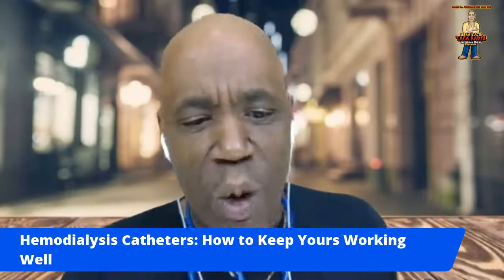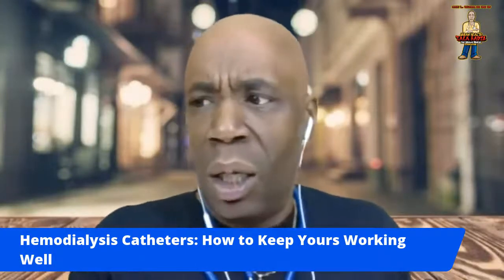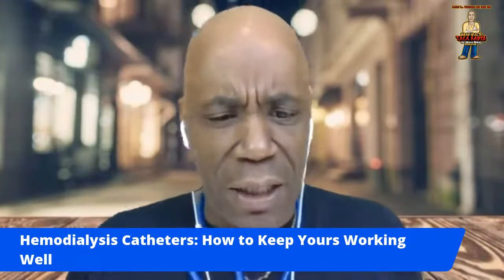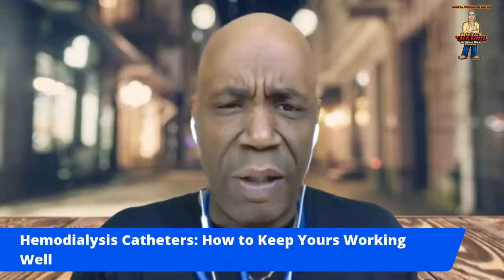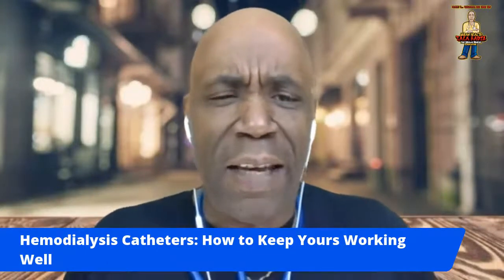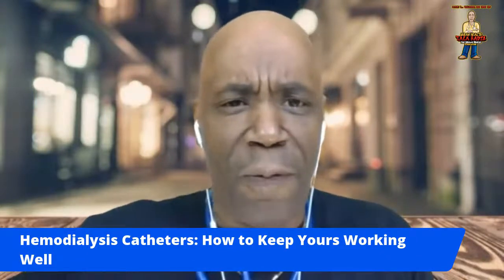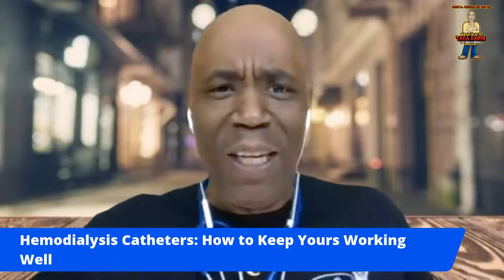Another question. Ask them, what is the flow rate that your doctor ordered? You want to know that. What is your blood flow rate that your doctor ordered when he started you on dialysis? Because some technicians, if your catheter is not working or if it's an issue, this is the real deal. As they say, for real, some techs, they don't tell you anything. If you start having issues, they'll just turn the blood flow rate down, especially if you sleep and don't tell you. So you may think you at 400 running, and in all actuality, you're running at 250 or 300. And don't even know it.